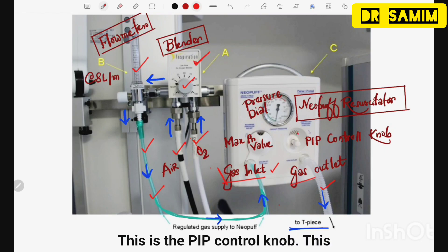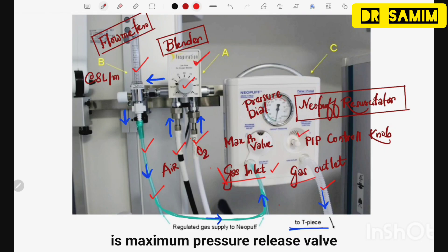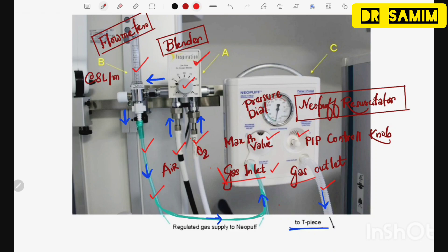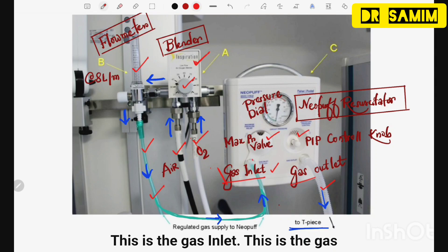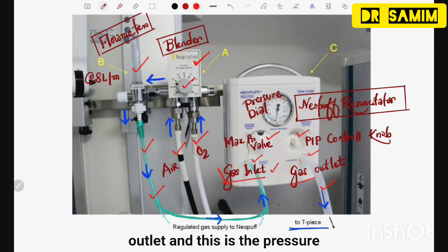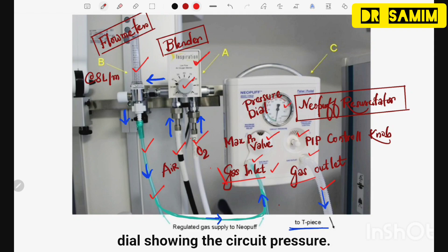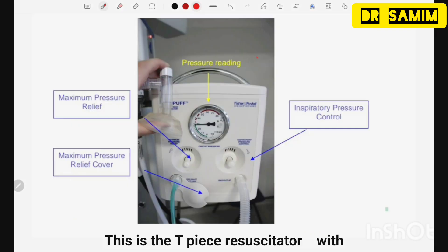This is the PIP control knob. This is the maximum pressure release valve. This is the gas inlet. This is the gas outlet. And this is the pressure dial showing the circuit pressure.